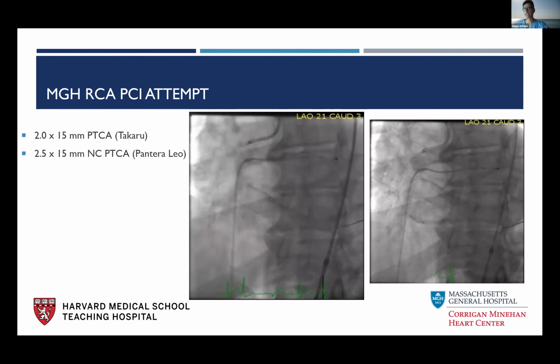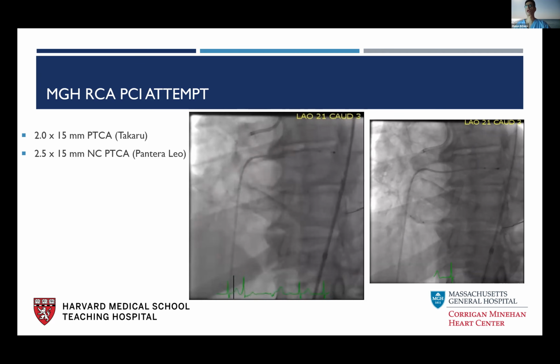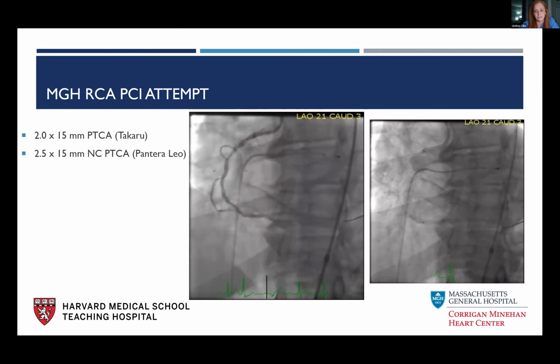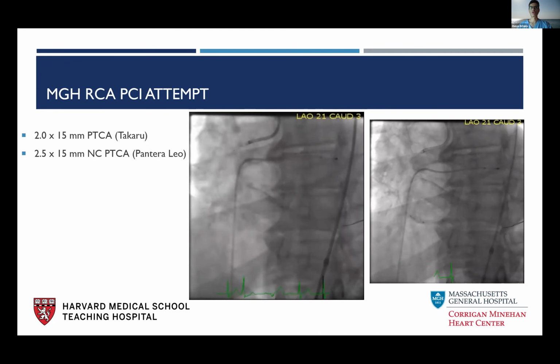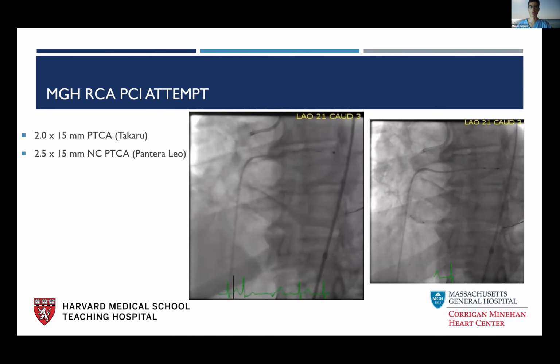And actually, speaking of this, did the patient go bradycardic and have to be paced during the atherectomy runs? No, surprisingly not. Did not require pacing. We had that in just in case because we knew we were going to use atherectomy, so just for backup, we put the temporary pacing in. Okay, wonderful. Perfect. It looks like a beautiful result and great modification of the lesion there.